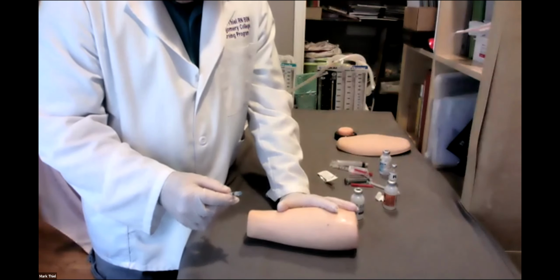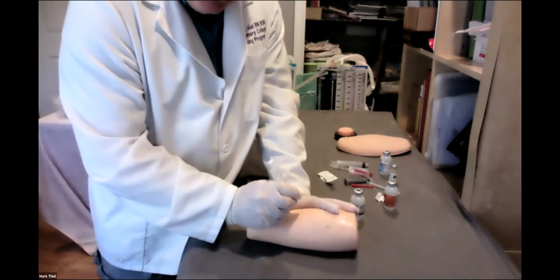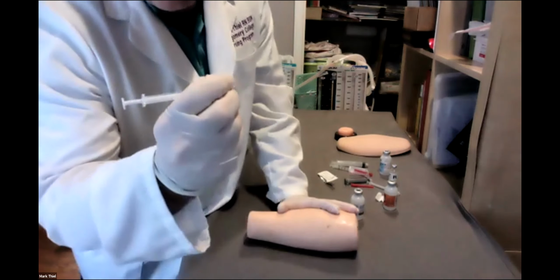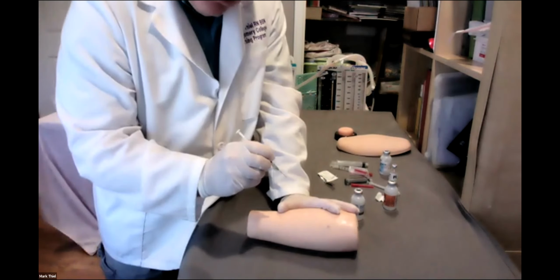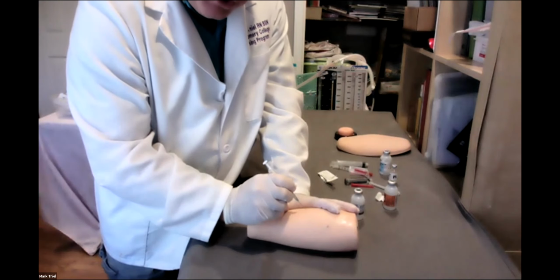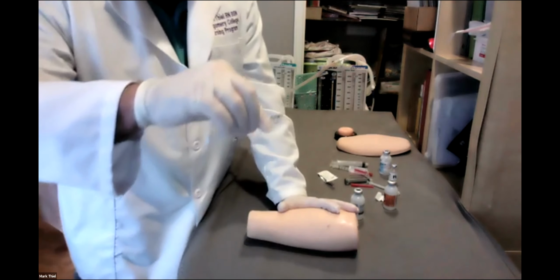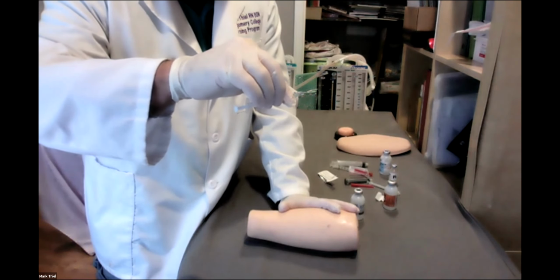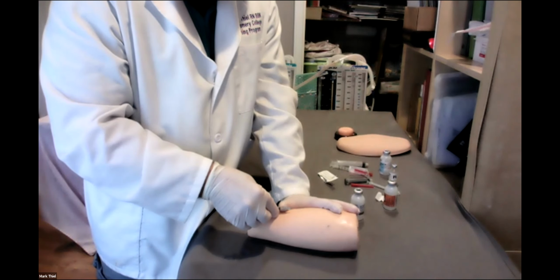Secure the arm. Now, distinction here is that we cannot inject in a dart fashion, can we? Because our angle of injection would have to be too steep. Today, in this, we hold the syringe like this, right?